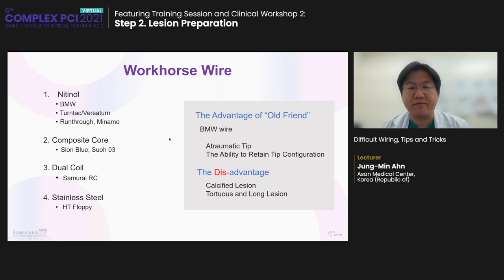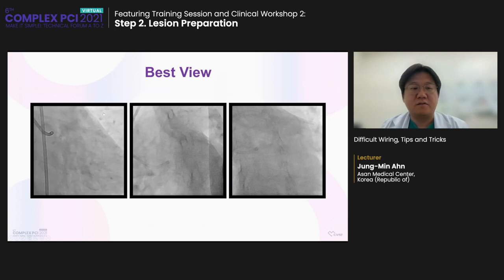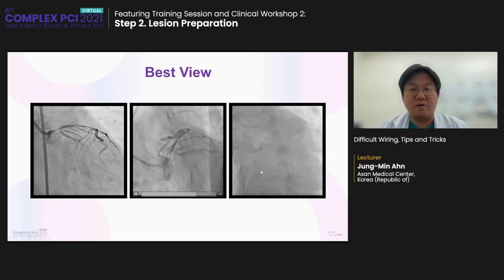So we have to know the characteristics of workhorse wires, so that if you are familiar with one workhorse wire, you can apply it to the other workhorse wires. Tip shaping is very important: for a larger vessel, larger coverage is necessary, and for a smaller vessel, smaller coverage is necessary. In addition, the best view is very important. I think the best view is more important than the wiring technique itself.